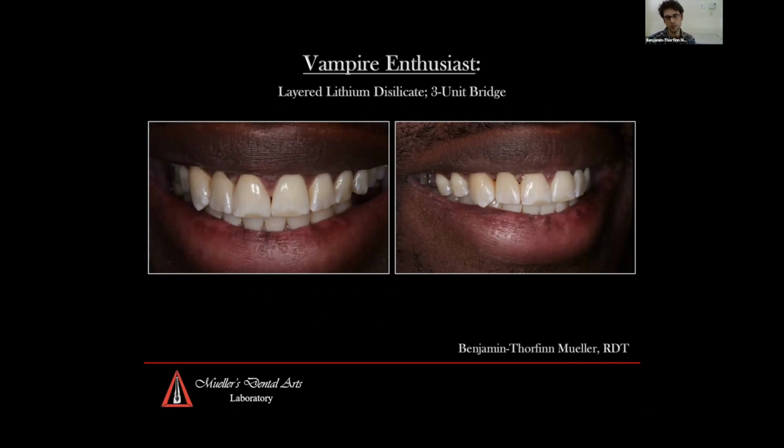But lo and behold, he had received some trauma to his joints, and every time he moved into that side shift and slow side movements, he cleared that canine completely. And the other side, of course, as you can see, is a different story. It's completely worn down. But again, just to demonstrate, keep things unique. Give patients what they want within their realms of possibility.